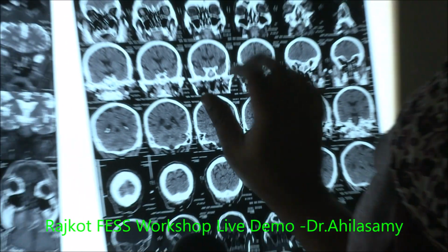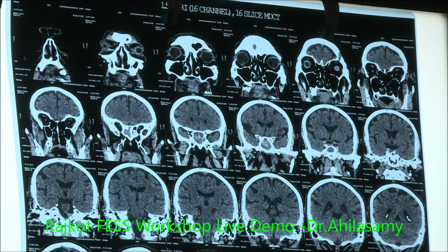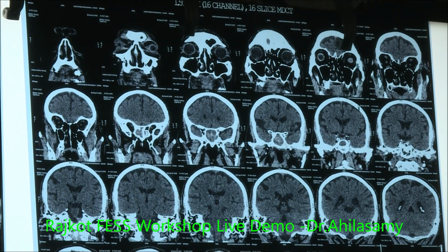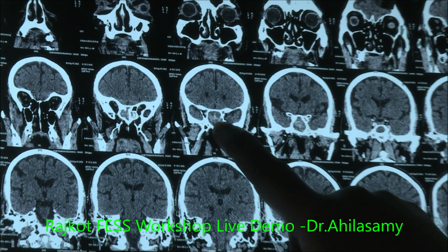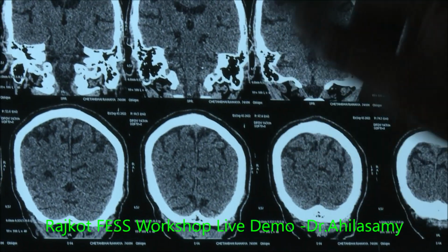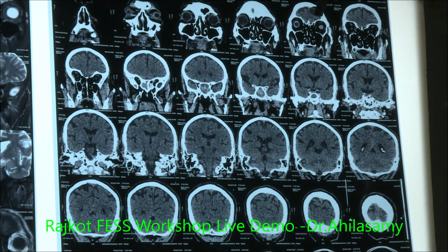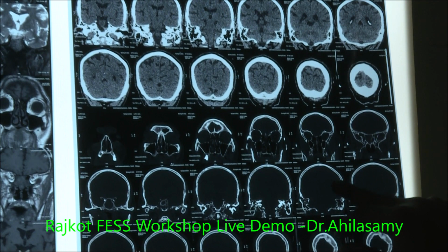The images are all very small, and it is very difficult for me to appreciate things. It's a pathology of the right sphenoid. These are all soft tissue windows. You can see heterodensity, which means it could be fungal. I don't want to explain everything, because you all know everything, and I don't want to jump directly into the diagnosis. The septum is fairly straight, so I will not be doing anything for the septum.